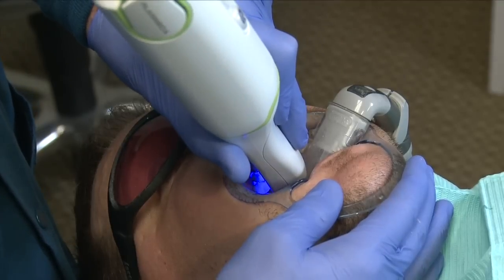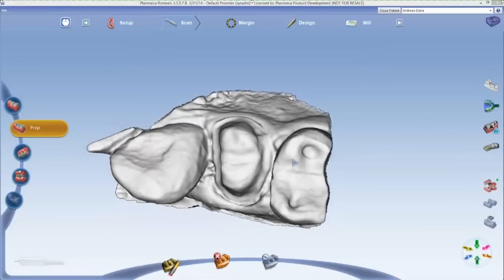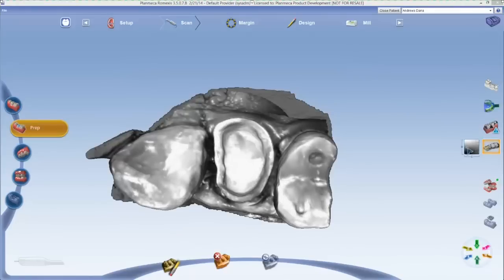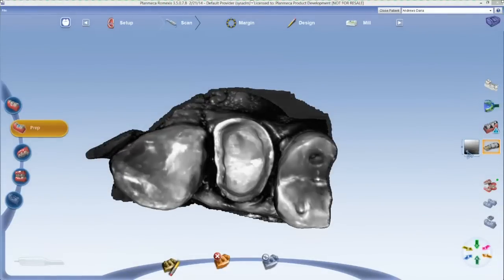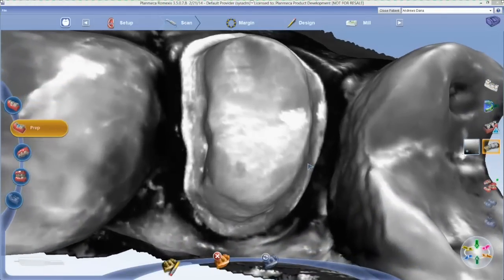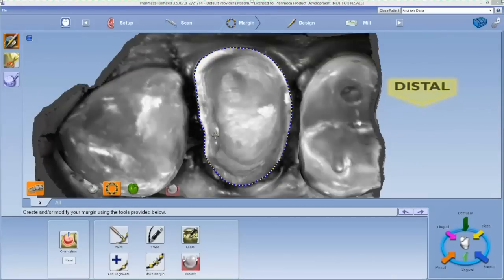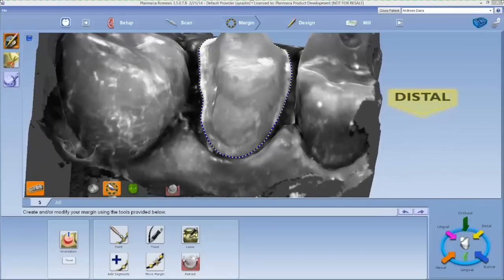In this case, we're using our PlanScan scanner, and we're going to rotate and roll it around so we can capture the interproximals and all the data that we need. Now, whenever we look at the stone model, the margin is not entirely clear. However, whenever we go over to our ice view, we can see very clearly the distinction between hard and soft tissue, even in the areas where our margin is subgingival. This gives us a high degree of confidence that we're going to be able to locate that margin accurately, and thus end up with a restoration that has excellent marginal fit. When I toggle back and forth between the stone view and the ice view after the margin has been located, we can see that our margin is located very accurately.